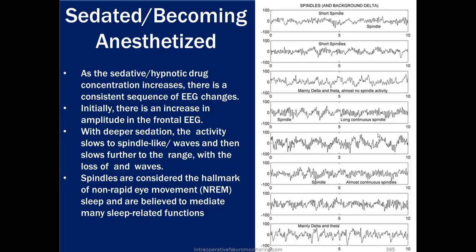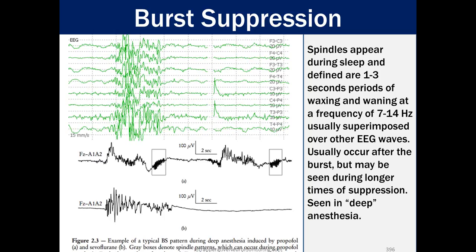And here, this picture does a pretty good job of labeling things when they're in spindles or delta and theta activity, and longer continuous strands of spindles. So that's a good picture to study, to try to get used to what you're looking at and then relate it to where the patient is as far as their level of sedation or sleepiness.